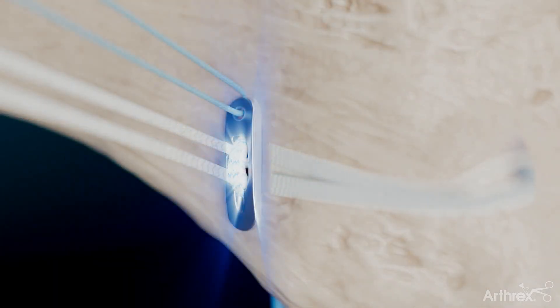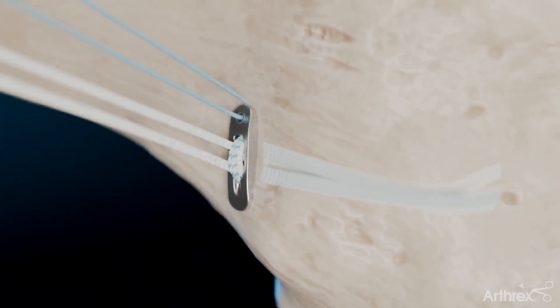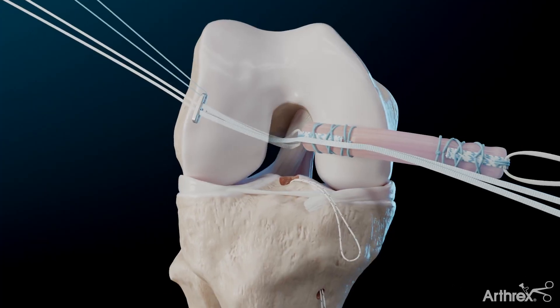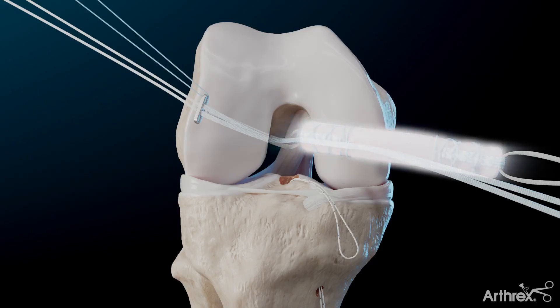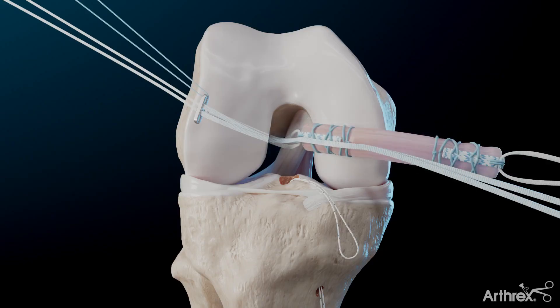Begin ACL graft passage by pulling in the femoral tightrope button through the socket and flipping onto the cortex. With the elongated femoral tightrope, the quad-link ACL graft should be sitting outside the joint.